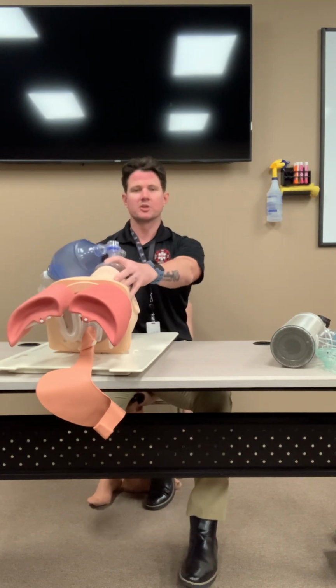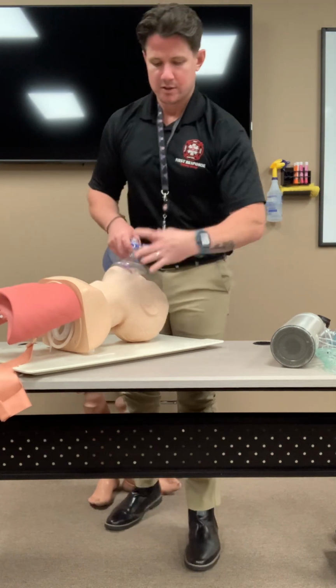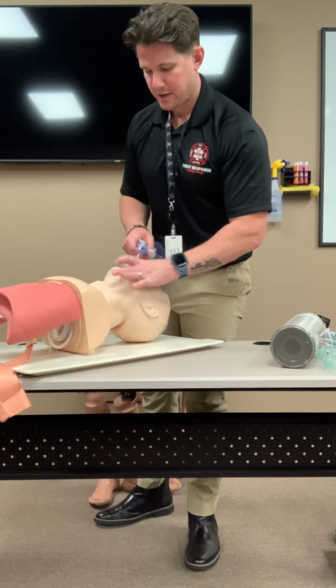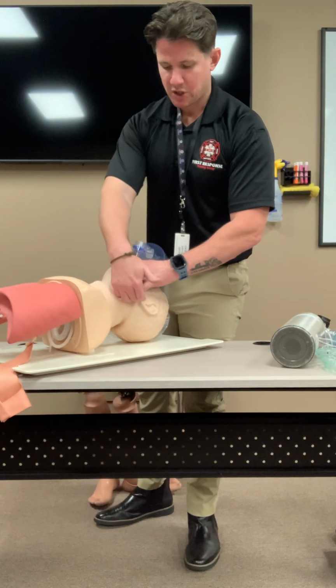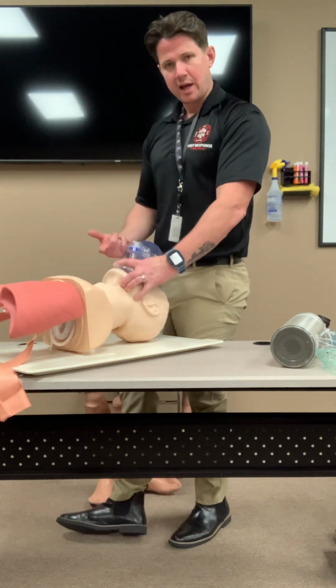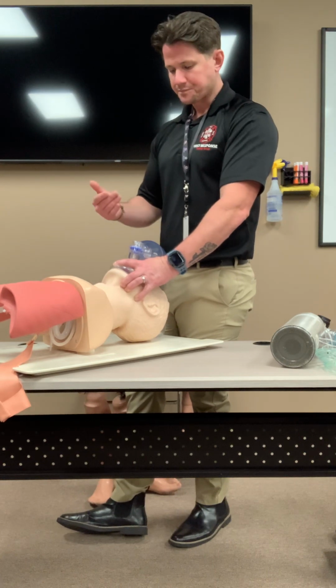Notice single person bag technique. I'm using the CE technique, okay? So my index finger and my thumb make a C around the mask, right? And then my other 3 fingers articulate the jaw up and into the mask, okay? This is key where people make a lot of mistakes in bagging, as I was telling some of you the other day, okay?